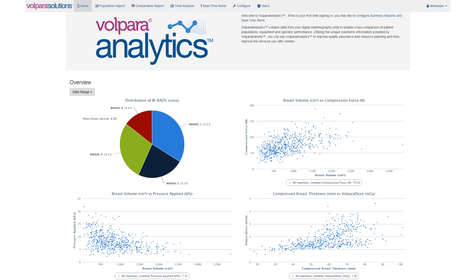Volpara Analytics is a reporting dashboard that uses your web browser to present key mammography metrics to assist quality assurance and resource planning. This objective imaging performance data enables the cross comparison of your screening population, mammography and tomosynthesis units, and operator performance.